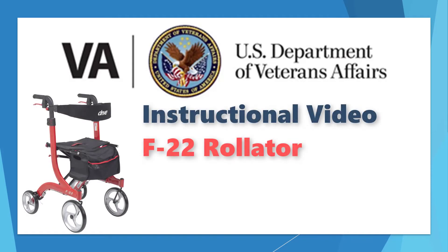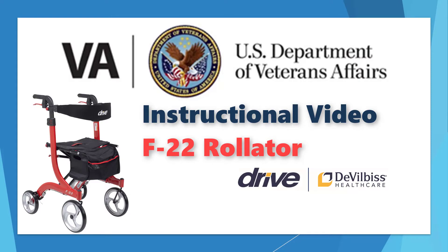Hello and thank you for choosing the F22 Rollator by Drive to Vilbis Healthcare. Your therapist at the local VA will be providing you with the F22 Rollator as a walking aid to help you with your mobility. This will help you to stay active and engaged in your normal daily activities while giving you the ability to sit and rest whenever needed.